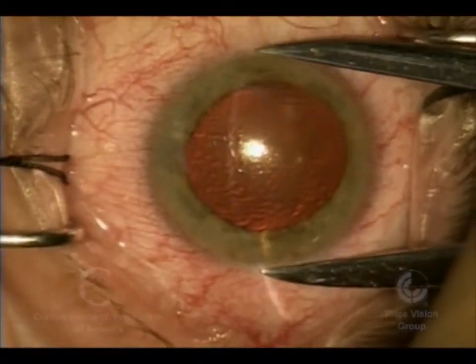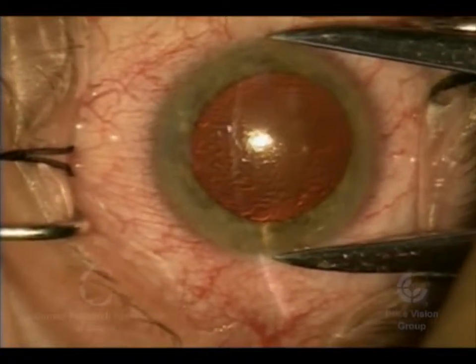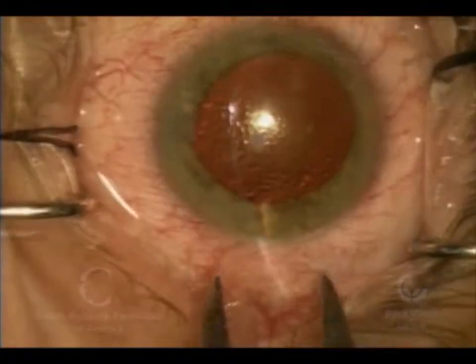Hi, this is Dr. Francis Price, and this is a case of DSEK — Descemet's Stripping Endothelial Keratoplasty — combined with cataract surgery.